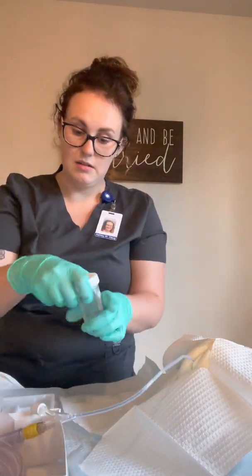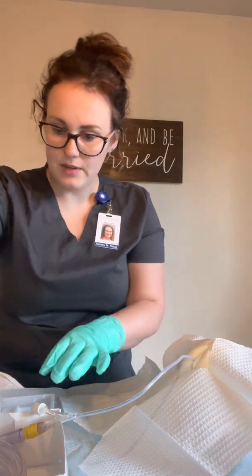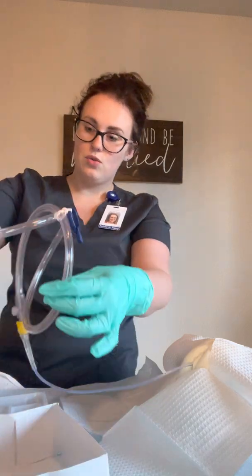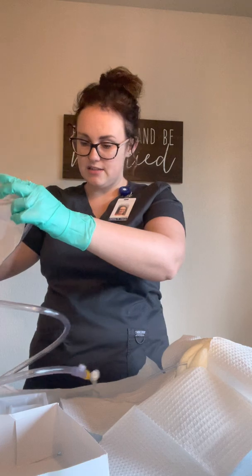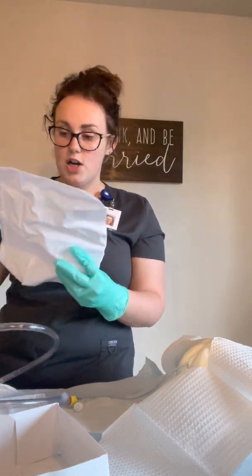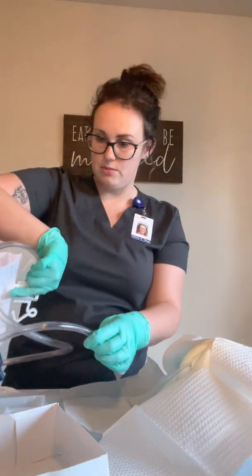And now what I'm going to do is I would collect my sample if I needed to, now that I have a fresh sample. And then I'm going to secure the bag to the patient's leg using an appropriate securement device so that we have it anchored and it's not going to risk pulling out or moving around. And then I will place the bag on the bed frame below the patient's bladder so that we have good drainage and that we're not backflowing into the patient's bladder.